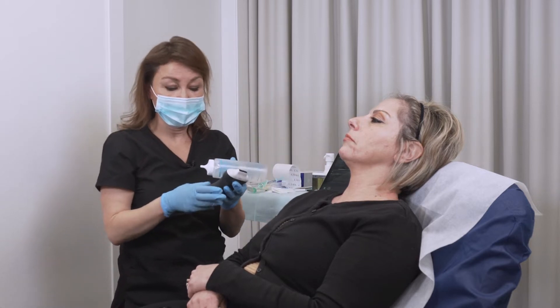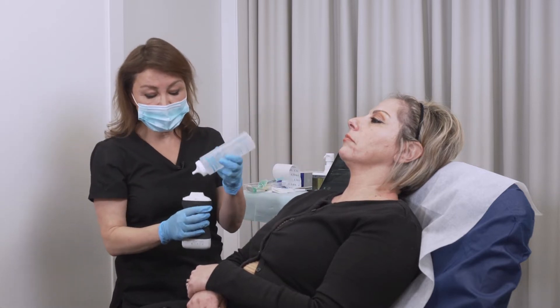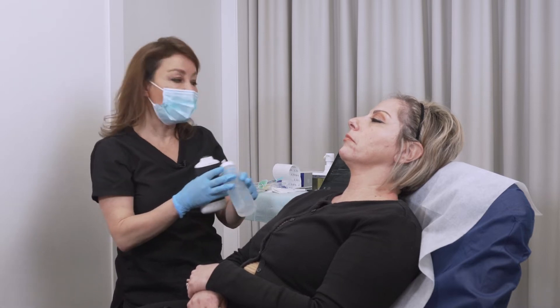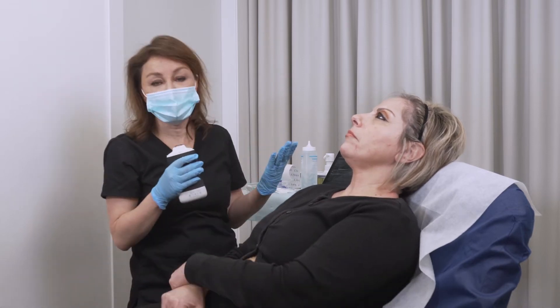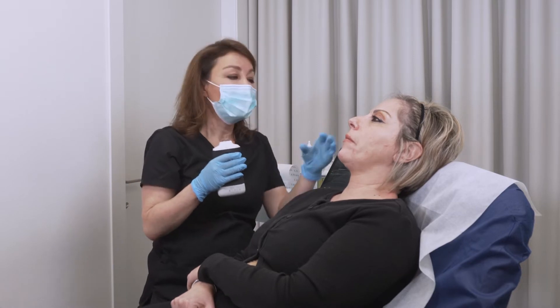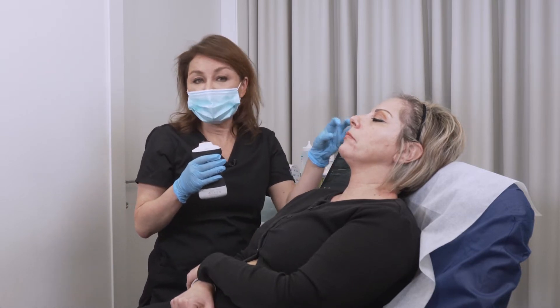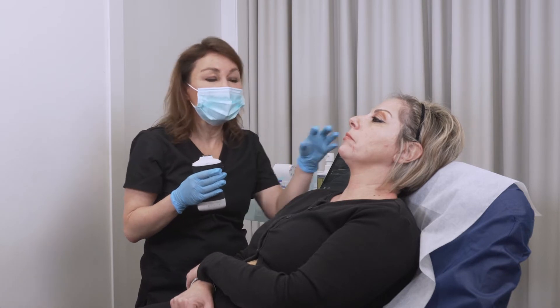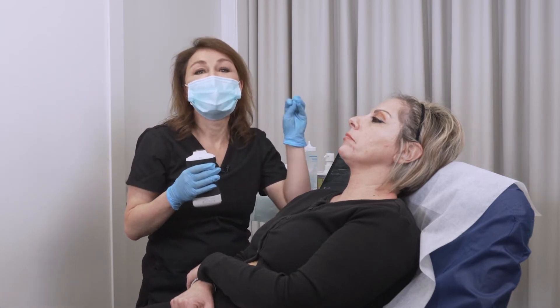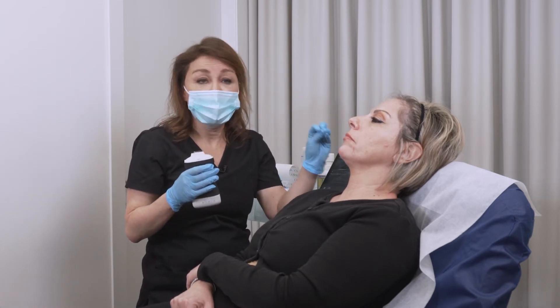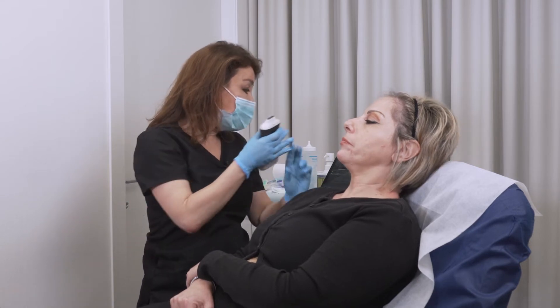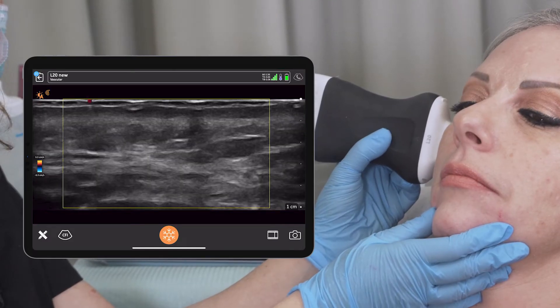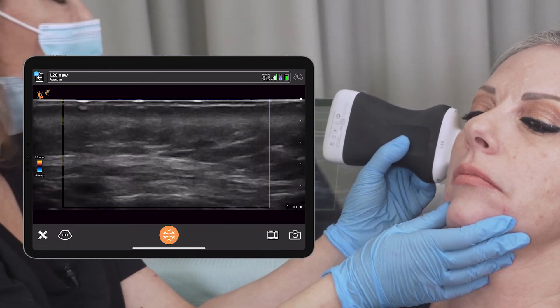On the lateral parts of her cheeks, it's not a danger zone — there are no known vessels that we can hit when we inject the lateral cheek on top of the bone. We can confirm this visually; I can see there are no bigger vessels there.